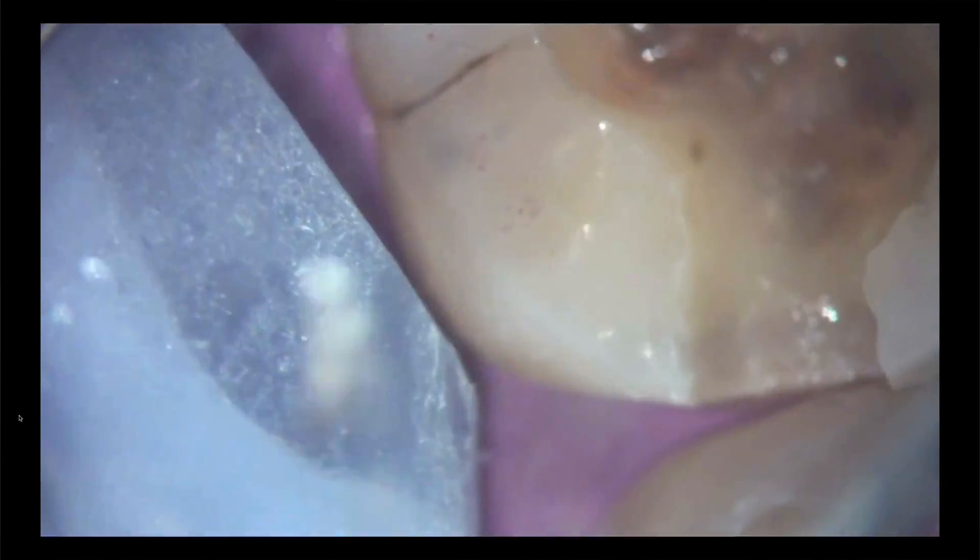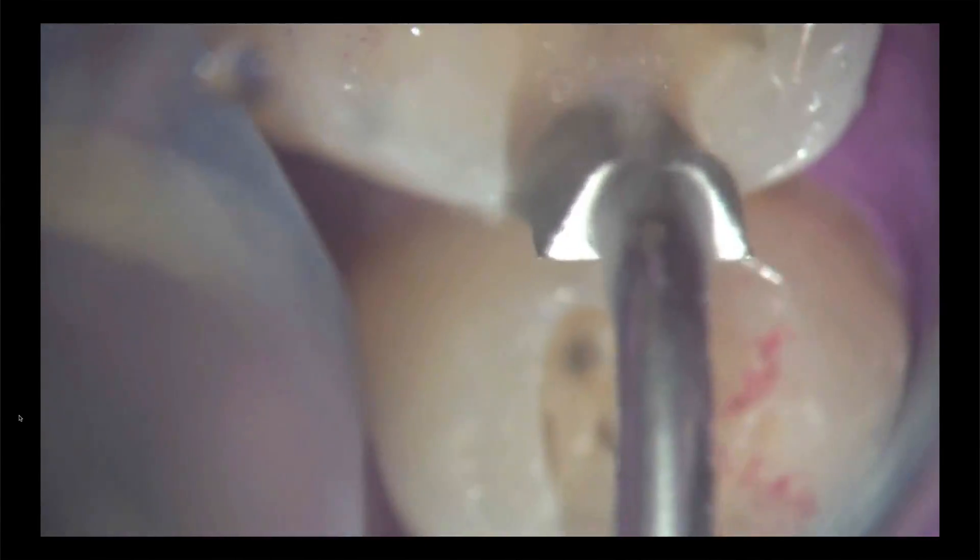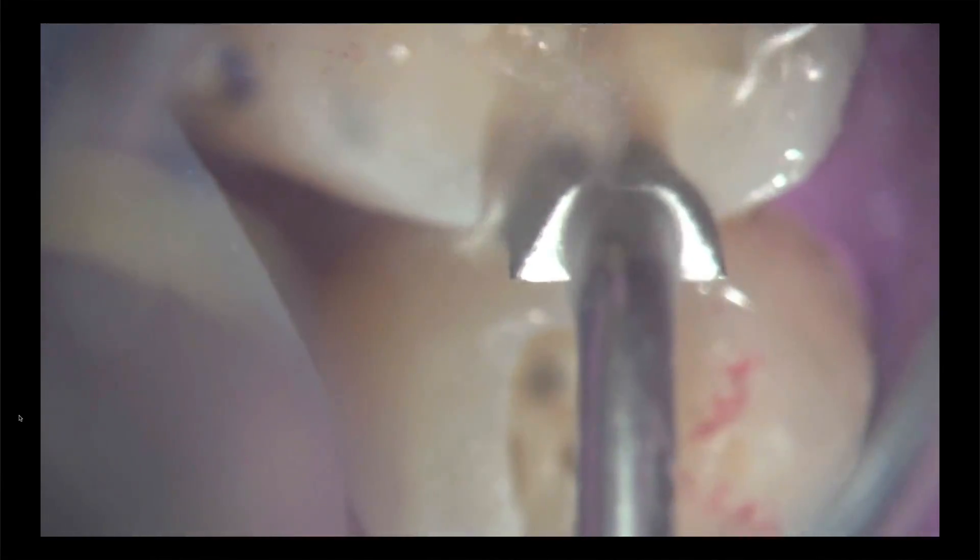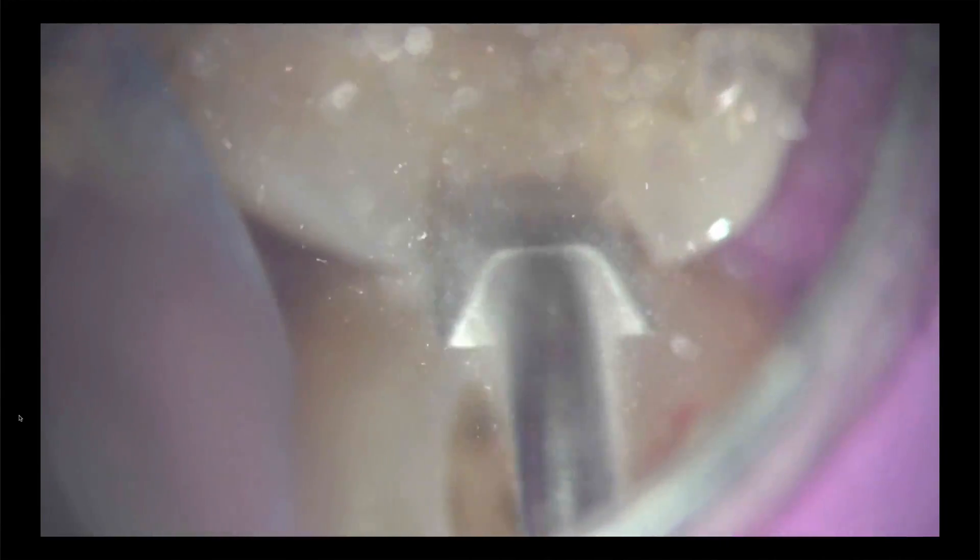And now I still have to extend this to the buckle a little bit more because there is caries there. So I'm going to make the box a little wider until I remove all the caries. And when I take this out, what you'll see is there's a little raggedness to the enamel. This is typical with the sonic instruments and you can use an enamel chisel or I just use a posterior 204 S scaler to smooth out the box form. But I wouldn't go in with a rotary diamond and smooth that out. It's smoothable with hand instruments. So you'll see, I'm just extending this to the buckle a little bit because of the caries that was there. This is a fantastic instrument. If you see what I just did there, made the box form with this instrument as opposed to a rotary instrument. It's really, truly fantastic. There's absolutely no way to nick or damage the adjacent bicuspid, the adjacent bicuspid surface. I think this is powerful instrument in dentistry.